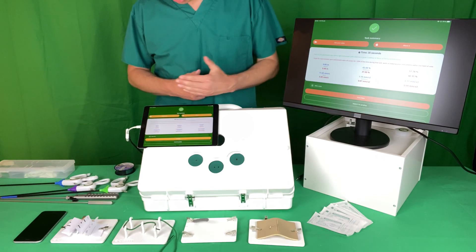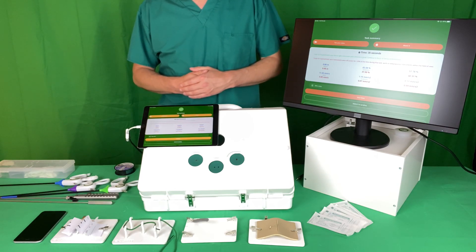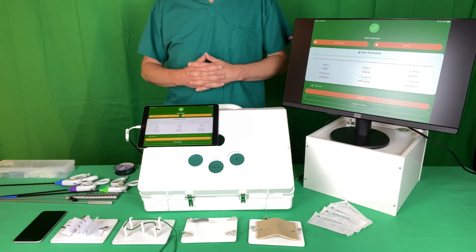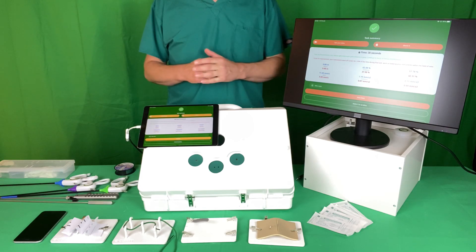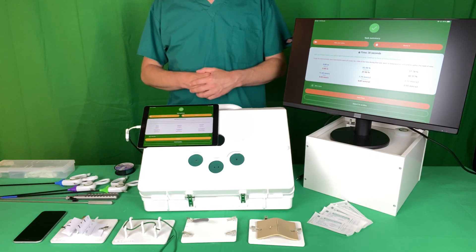In red, for that procedure, I've got 'scope for improvement — your instruments were off screen for greater than 20% of the time, work on keeping your instruments within the field of view.' This is based on studies using this equipment that demonstrate more experienced surgeons keep their instruments within the operative field for a much higher percentage of the time than novices.